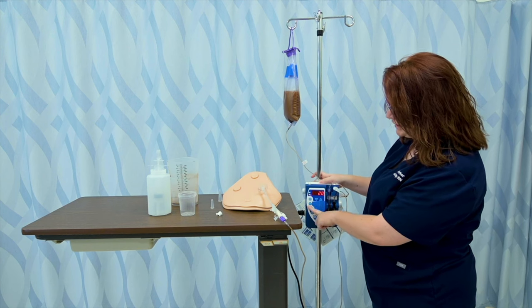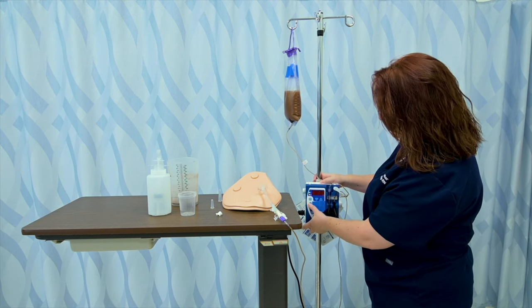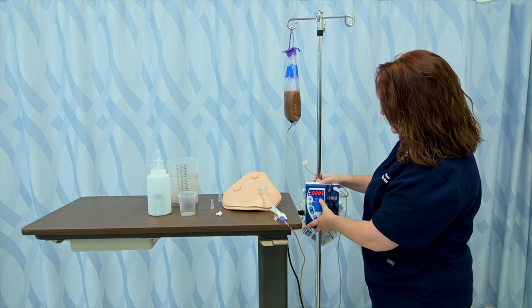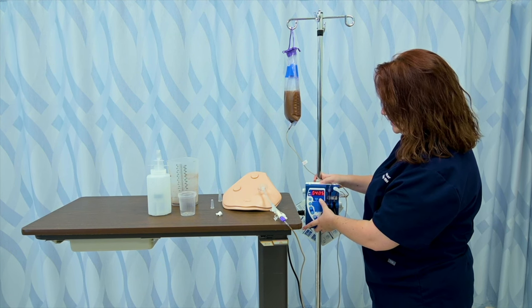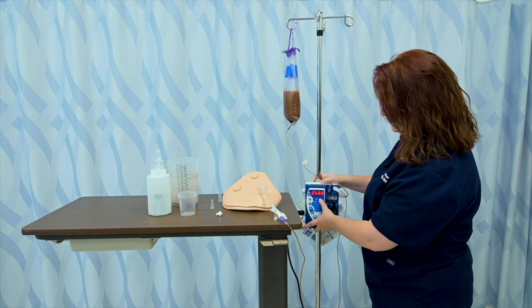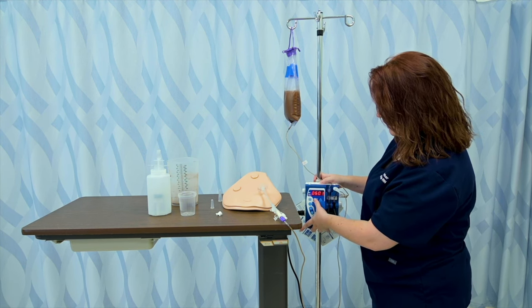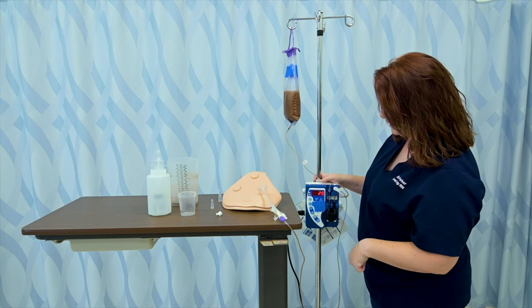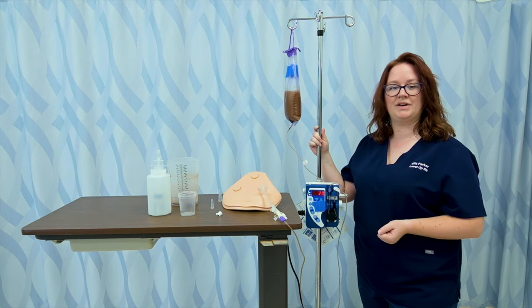There's also a VTBD button — that's volume to be delivered. I'm going to click on that button and set it; we have 600 milliliters in our bag today. Once that's done, I can go ahead and hit start, and my volume will begin being delivered. And that's how you set up a tube feeding.